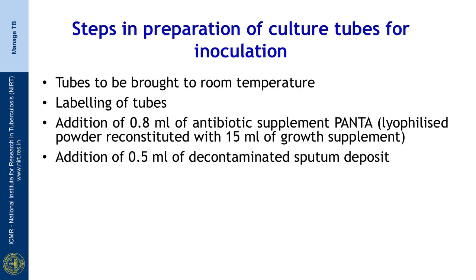0.8 ml of the antibiotic supplement PANTA, which consists of polymyxin B, amphotericin B, nalidixic acid, trimethoprim, and azlocillin — available in a lyophilized powder form — has to be reconstituted with 15 ml of the growth supplement. Then, addition of 0.5 ml of the decontaminated sputum deposit should be done.